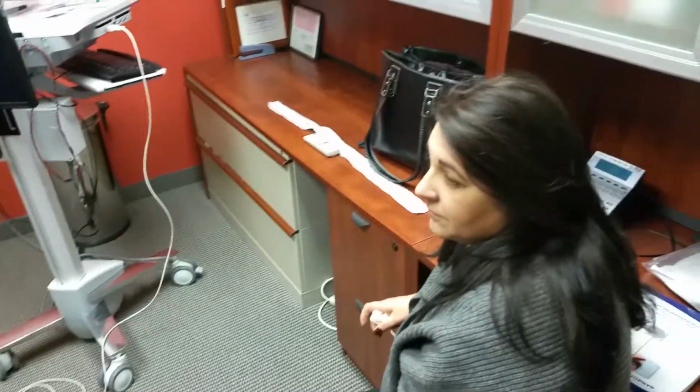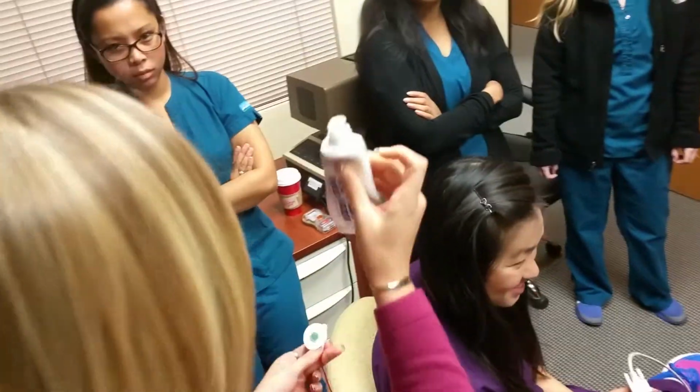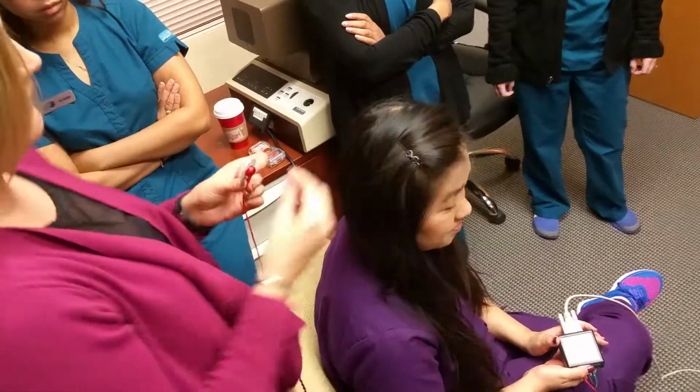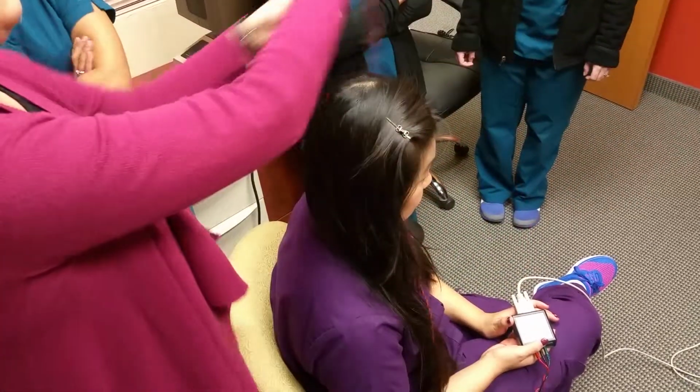So when it comes to your conductive paste, you guys can never use too much, but you can use not enough. So obviously the one in the back of the head takes more than the one in the front. Okay, you go ahead and squeeze out what you need. You're going to hold it sideways and scrape it off. Alright, look straight ahead for me. Did you scrub this side of her forehead or this side? The left side. Okay, so I'm going to put this over here.